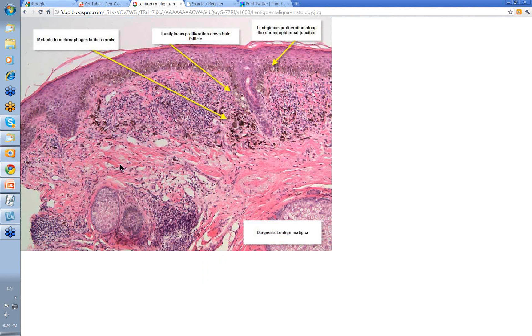Let's have a little look at the histology of lentigo maligna. You see proliferation of atypical melanocytes along the dermal-epidermal junction and accentuation down the hair follicles. There's a lot of pigment in melanophages. Sometimes you may have some little nests in lentigo maligna as well, but not many. Mostly it's this linear type of proliferation of atypical melanocytes down the follicles.